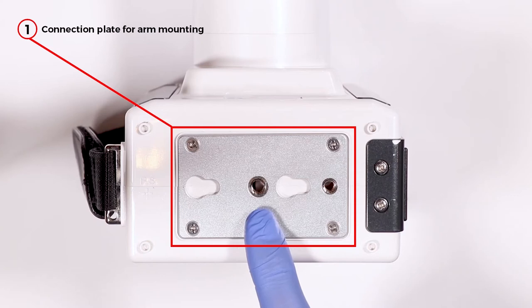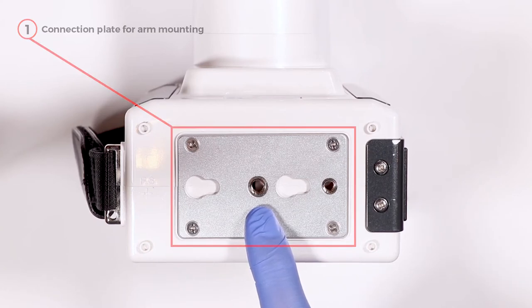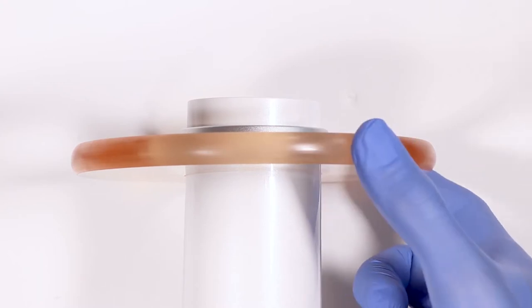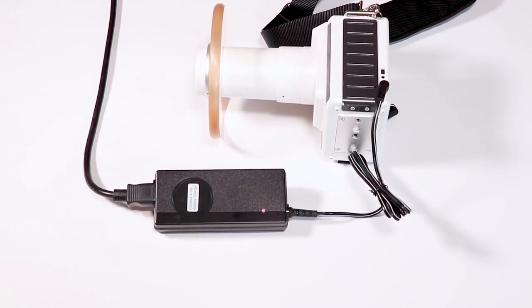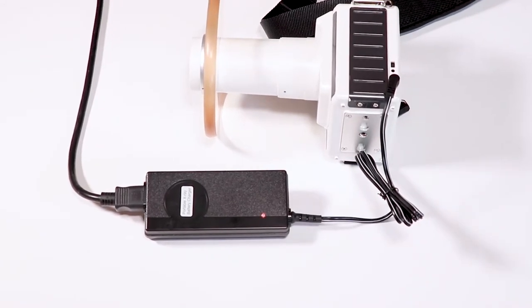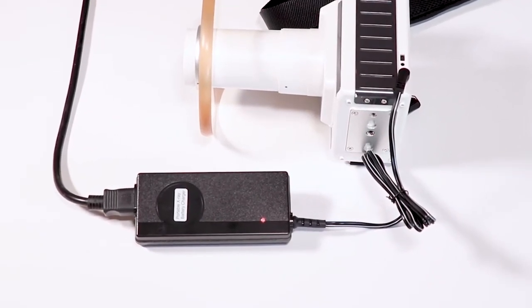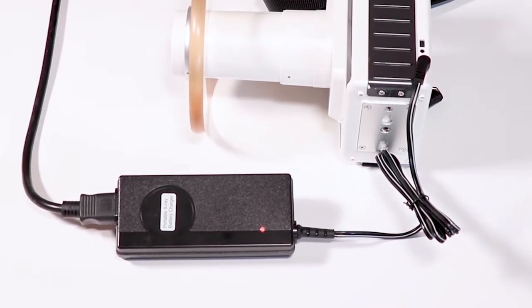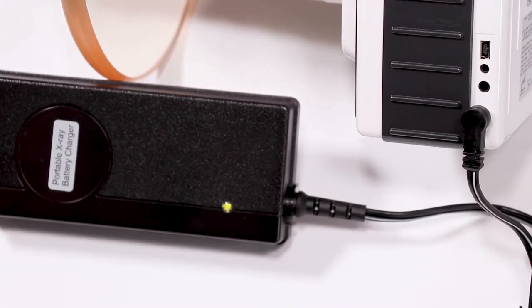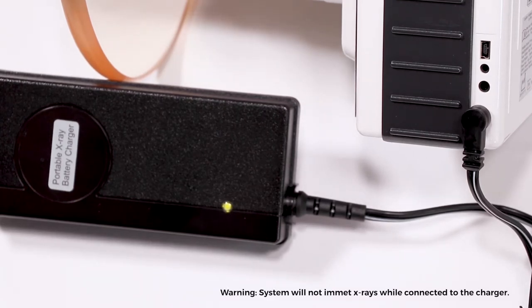The bottom of the X-ray is a connection plate for arm mounting. Note that the backscatter shield on XTG is fixed. When charging the unit, a fully depleted battery takes approximately 3 hours to charge. Notice the red light on the charger will illuminate, then changing to green when fully charged. This system will not emit X-rays while connected to a charger.